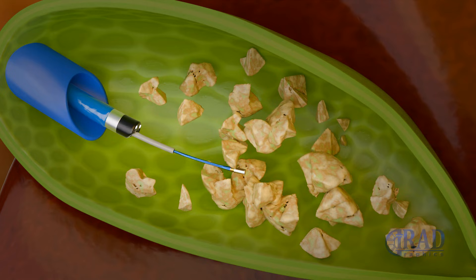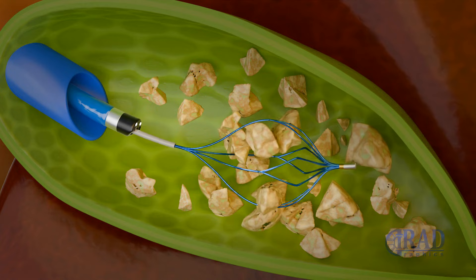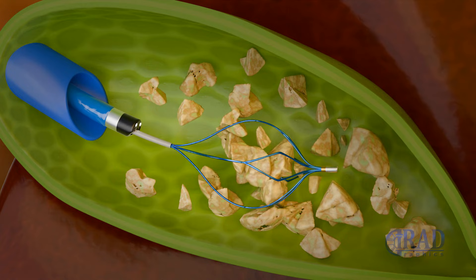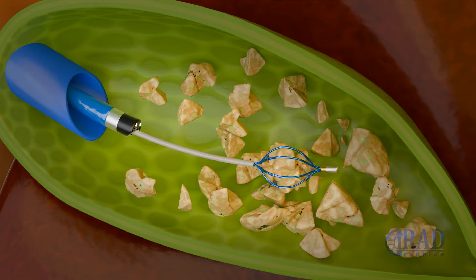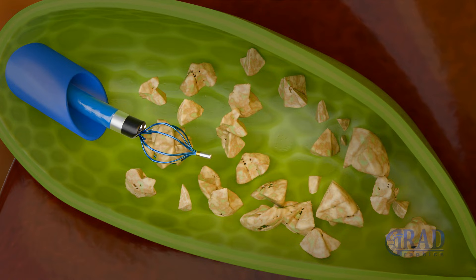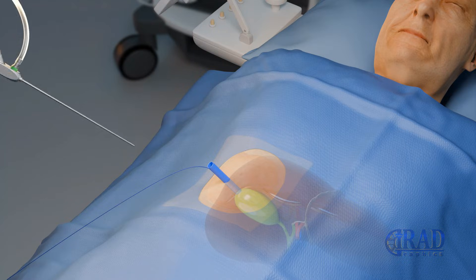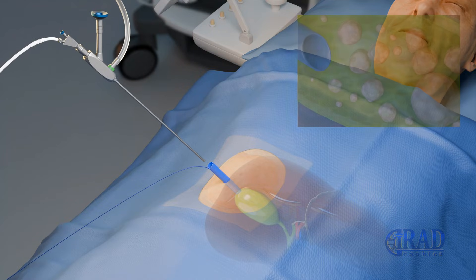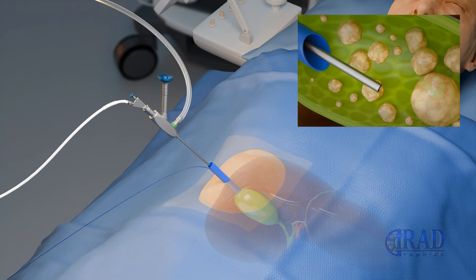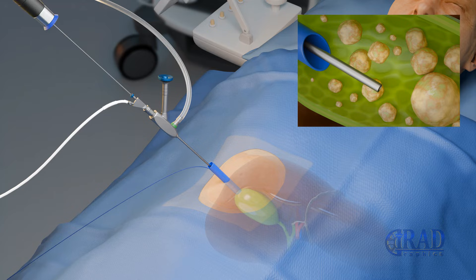Once the stones are fragmented, a variety of stone retrieval baskets and irrigation techniques are employed to clean the gallbladder of stone fragments, ensuring complete clearance. In some institutions, a rigid scope combined with a shock pulse lithotriptor is used to pulverize stones into fine particles.